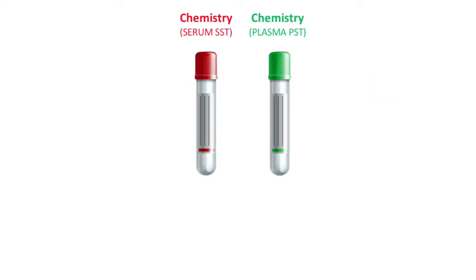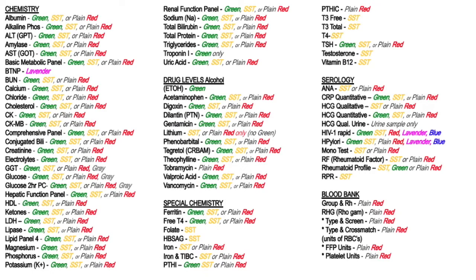Because literally every single other test question that you are going to get goes into a chemistry tube. There are hundreds of different chemistry tests. We don't know where they're going to go, what they're going to go into, and sometimes we won't even recognize them. In class, you might not even talk about them.